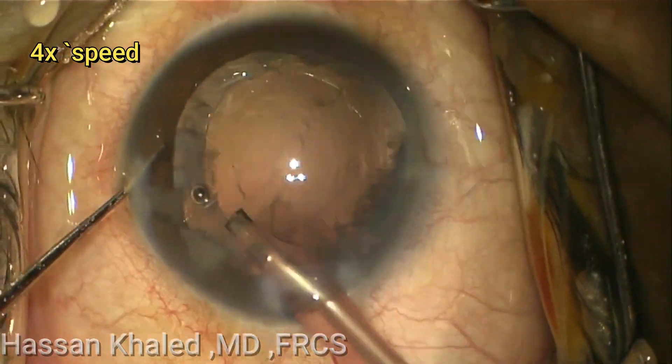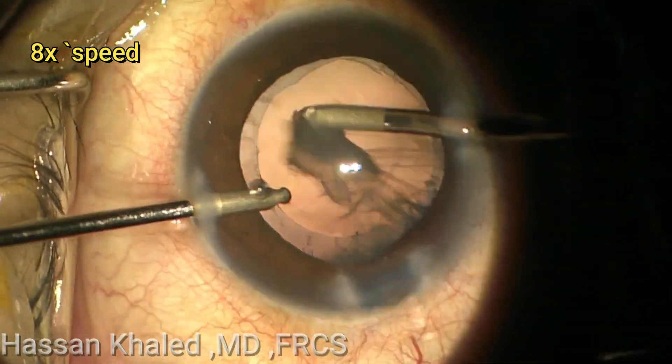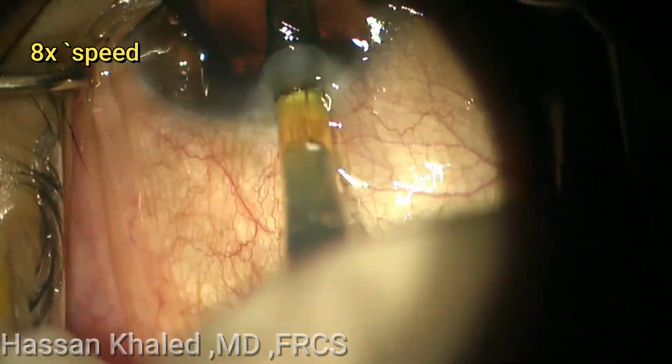After emulsifying this dense cataract, cleaning the cortex using the bi-manual irrigation aspiration. Then implanting a single-piece hydrophobic IOL inside the capsular bag.